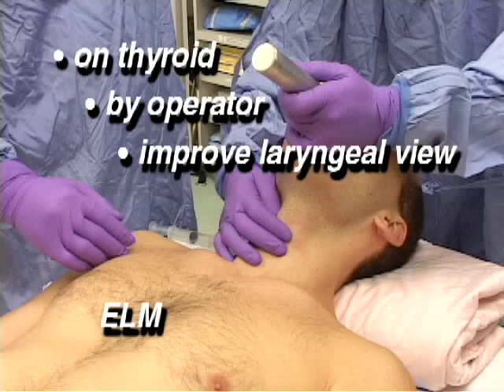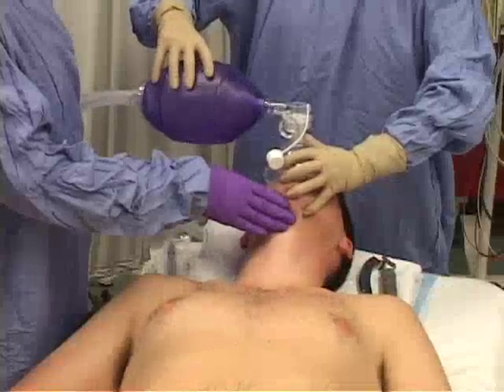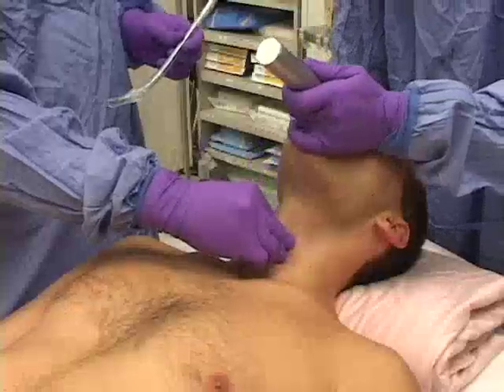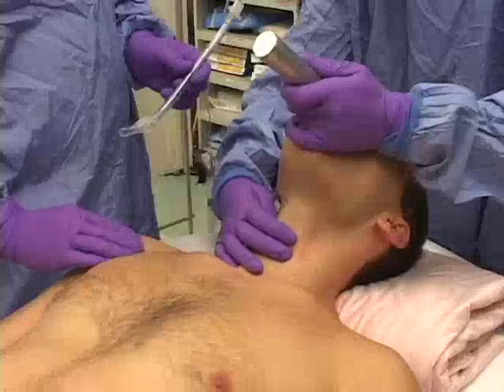The goal is first-pass success and avoiding episodes of bag-mask ventilation. Fine movements of the blade tip at the vallecula and subtle changes in pressure and direction of force can cause dramatic differences in laryngeal exposure. Bimanual laryngoscopy is about connecting these fine movements at the anterior neck with direct observation of laryngeal view.